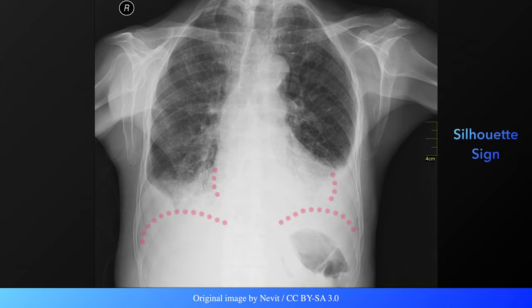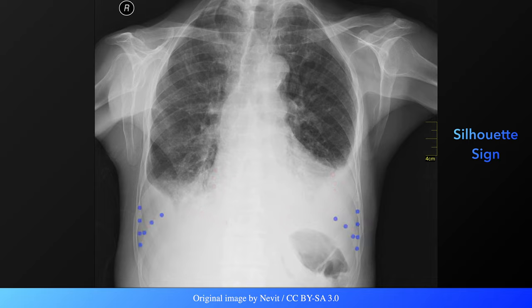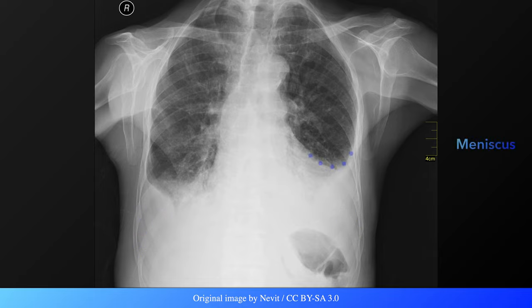Due to this dense opacity, the interface between the fluid and the heart border and hemidiaphragm is indistinct. This is known as the silhouette sign. Similarly, the costophrenic angle is completely obliterated due to the presence of pleural fluid.